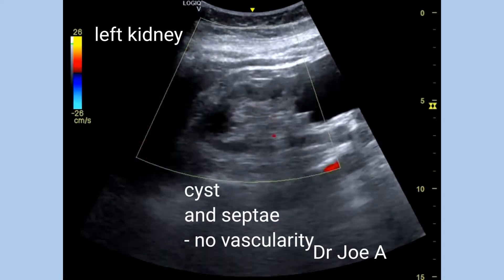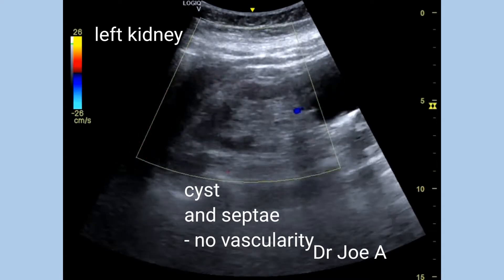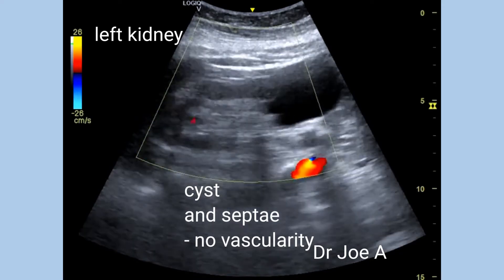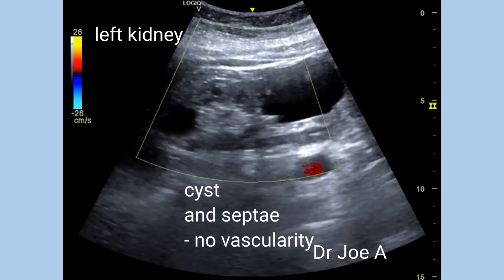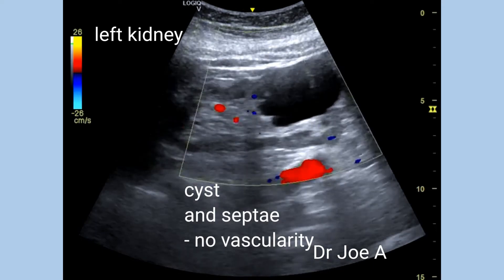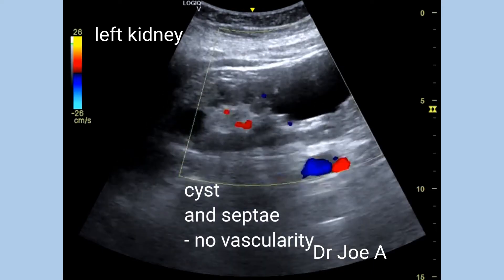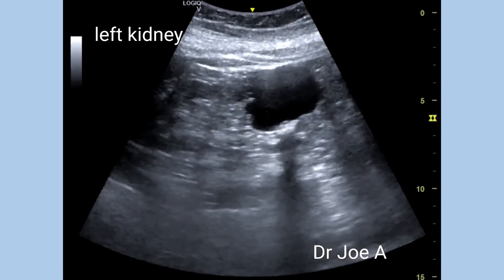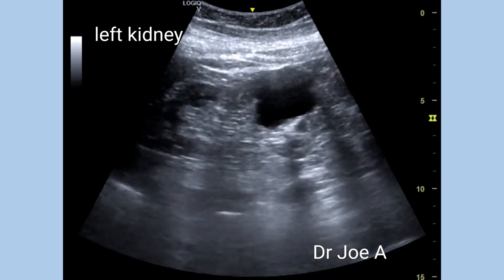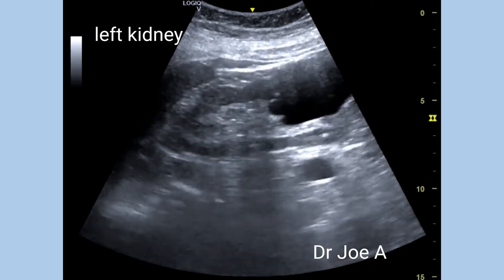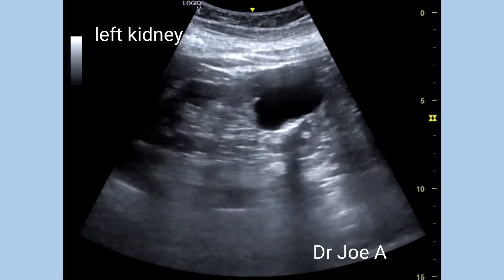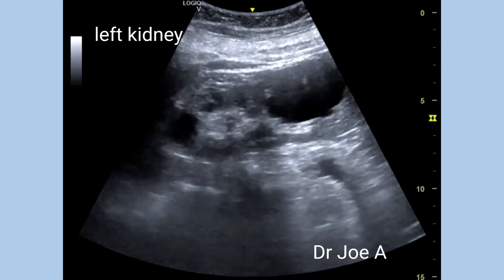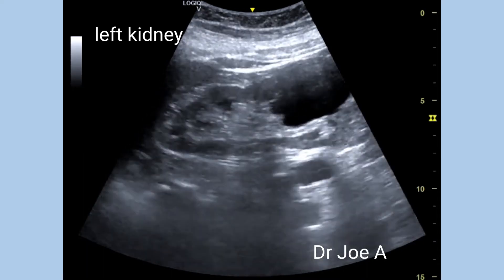Color Doppler ultrasound shows lack of vascularity of the cyst and the septae. Type 2F means this is a Bosniak type 2 cyst which needs follow-up — hence the 'F' for follow-up. This type of Bosniak type 2F cyst has less than 5% chance of malignancy.